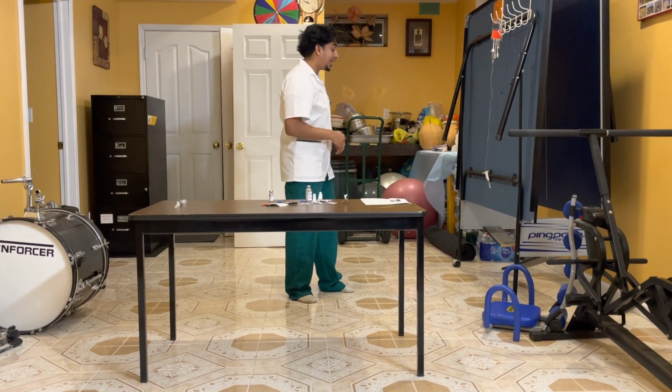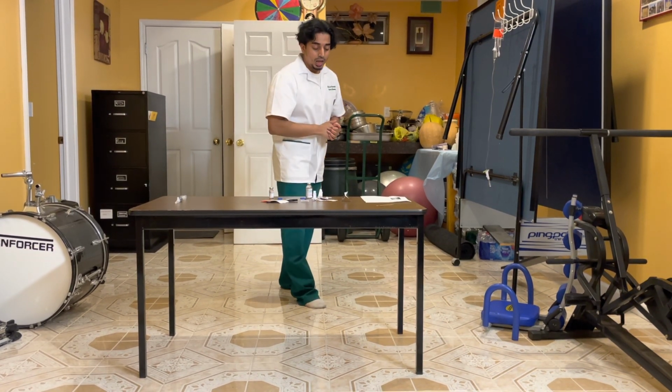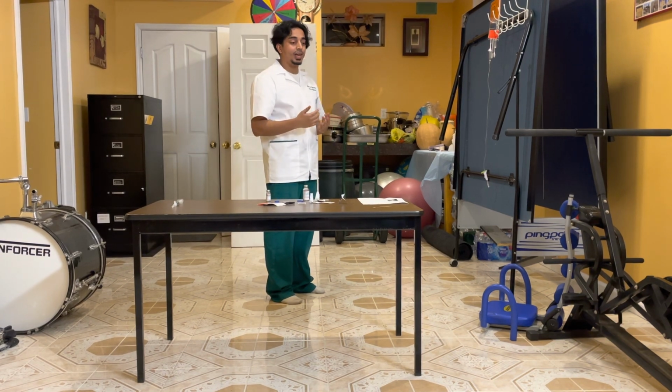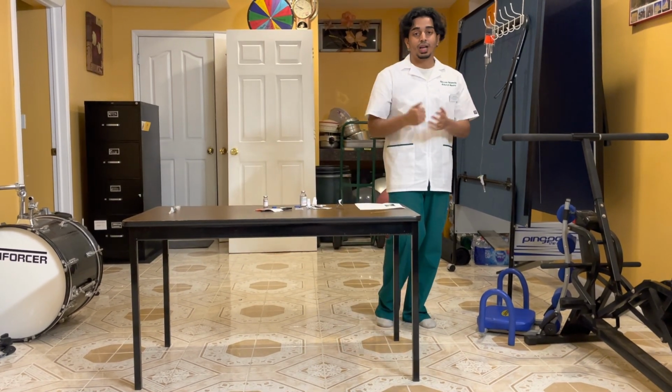And now that I've done that, I let the patient know that I will be transferring this information, the medication, and what I've done to the EHR as well as to the intake and output. Now that I've done that, I clean up, I do proper hand hygiene, and I leave the room, and that's IV piggyback.